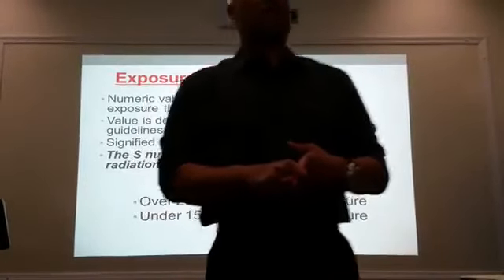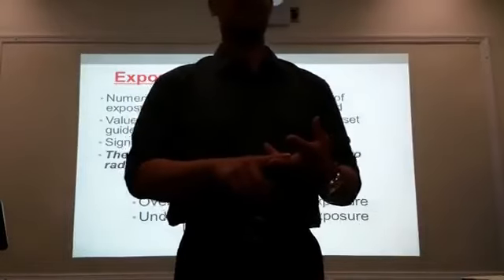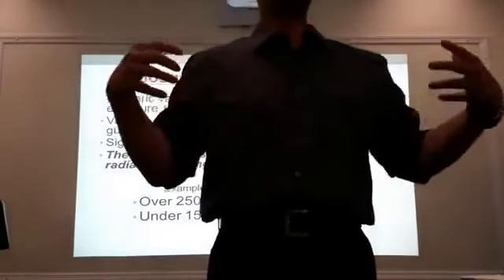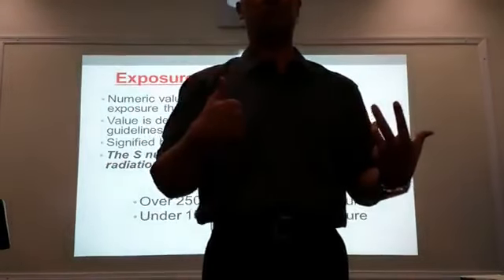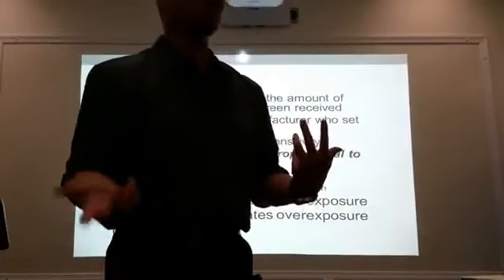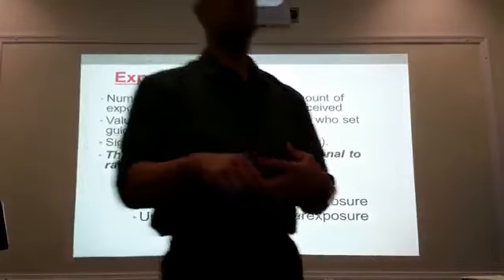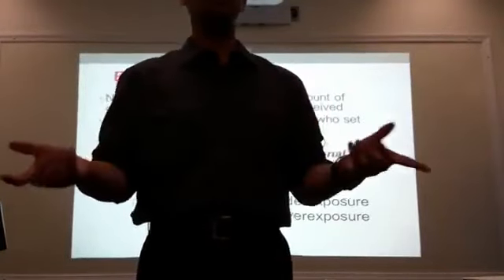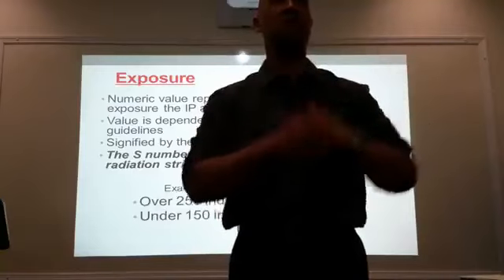Okay. It can and it cannot. This is why we give you the foundation of mA and kV. We give you the concept of mA and kV and what it does to radiation exposure, which the machine does understand. But the bottom line is we control that. We're going to control the kV and the mAs because the computer cannot determine the size and shape of the patient. The machine cannot determine what kind of pathology the patient has. These are all things that we have to consider when trying to determine the combination of technical factors that we use. It's not automatic with our X-ray machines.